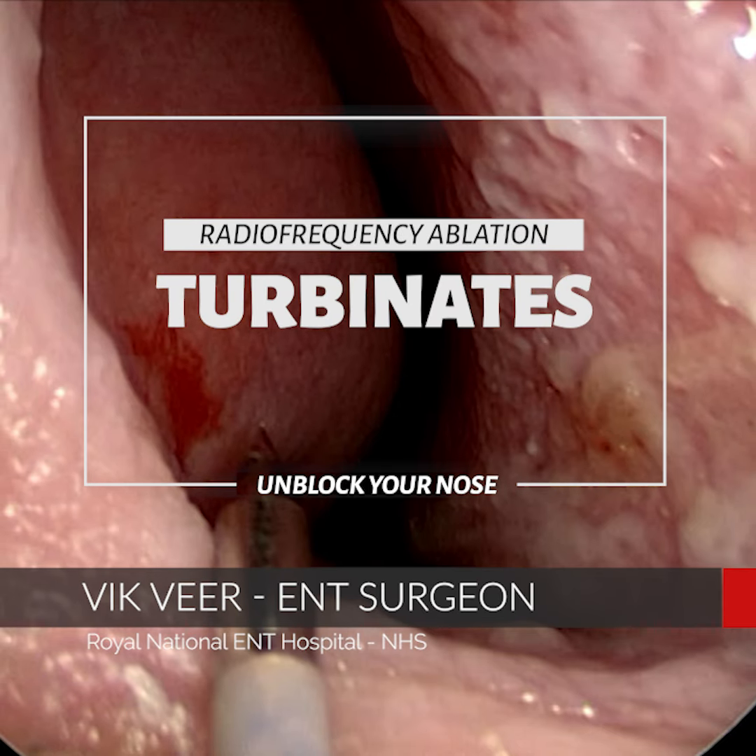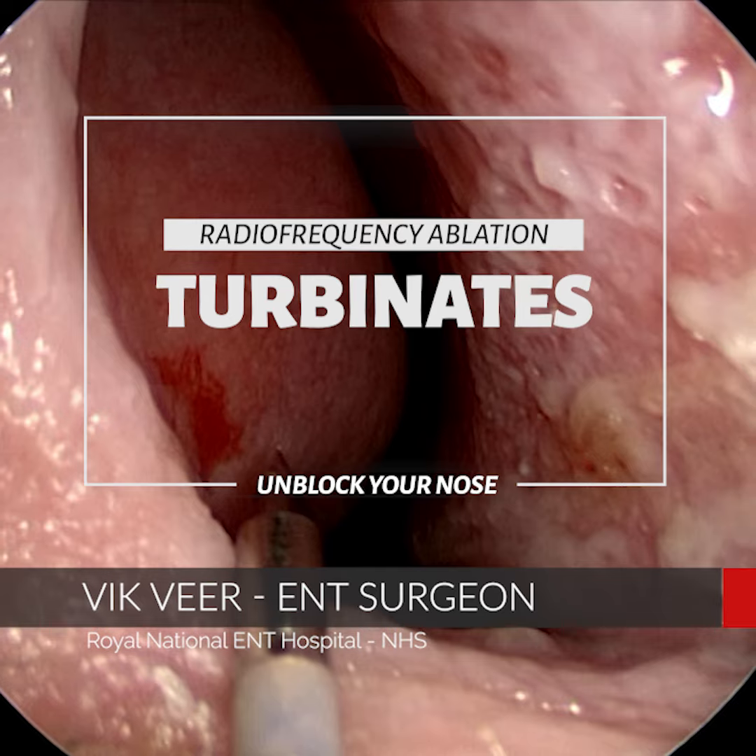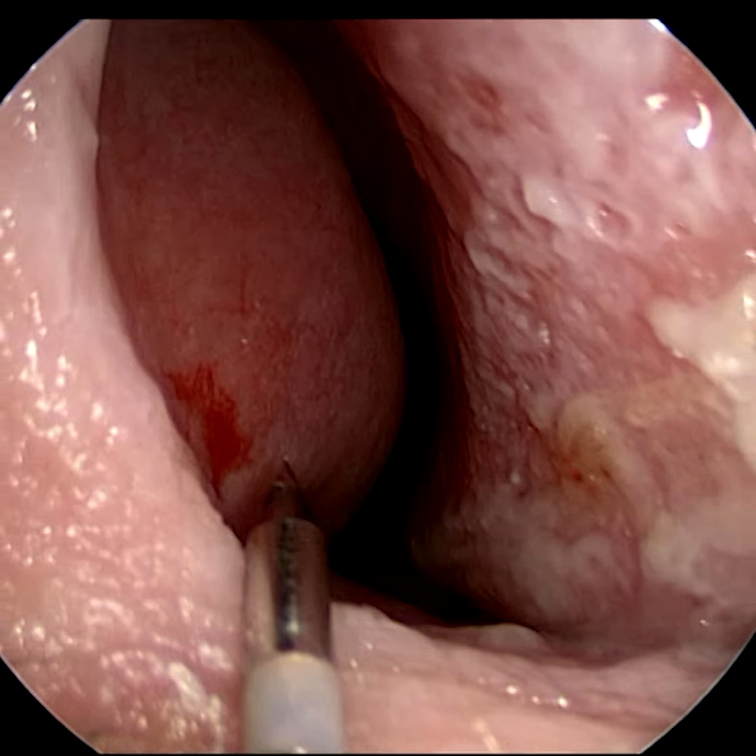Hi there, it's Vic Veer here again and this is another short operative video for you. This time I'm going to tell you all about radiofrequency ablation and what it can do for your nasal breathing.